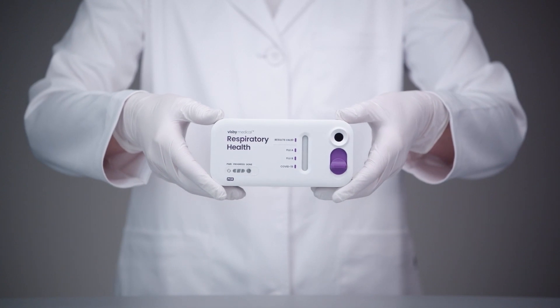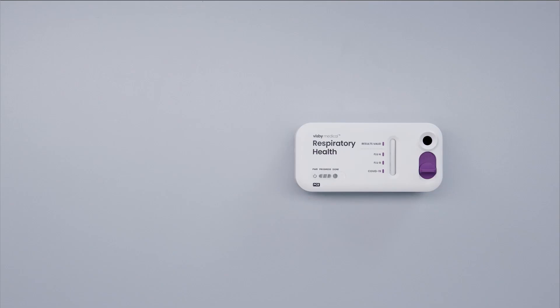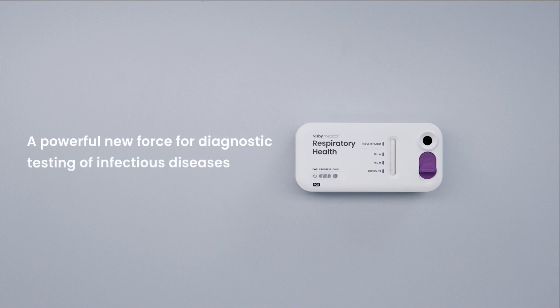This video demonstrates how to properly run the Visby Medical Respiratory Health Test, a powerful new force for diagnostic testing of infectious diseases.